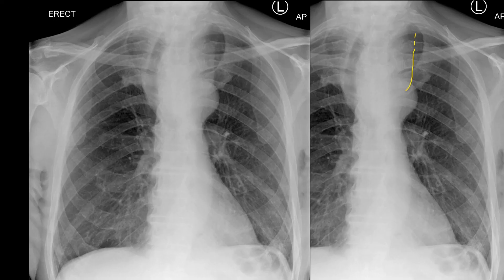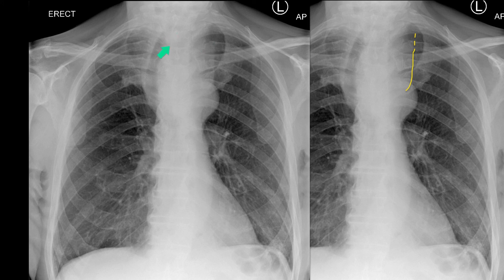Another form of the incomplete border sign could exist with a mediastinal mass lesion. This one is an anterior mediastinal mass, which is well-defined until it gets to the clavicle, and then it becomes ill-defined. Note the tracheal shift. And this is a case of a retrosternal goiter.